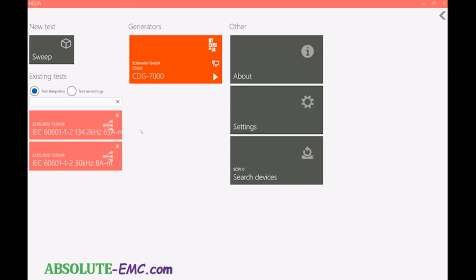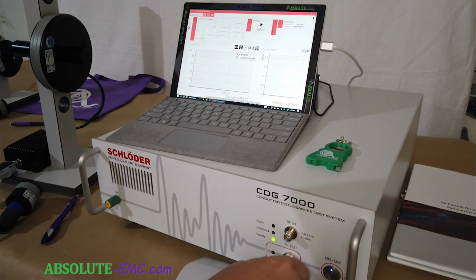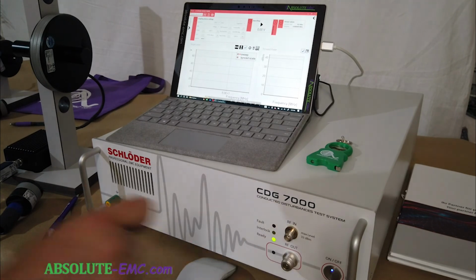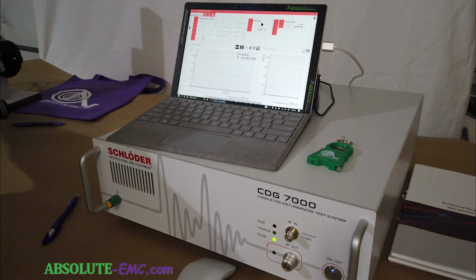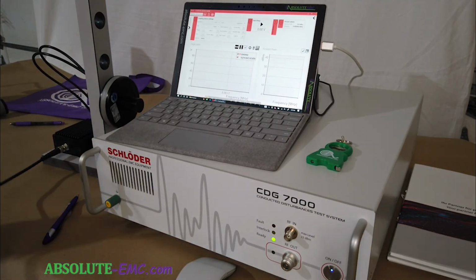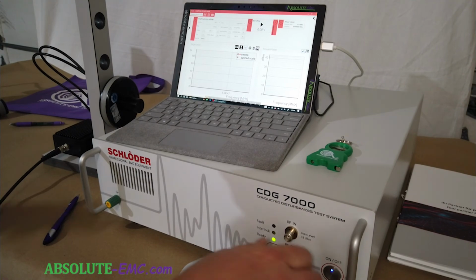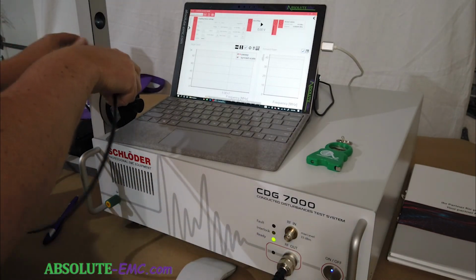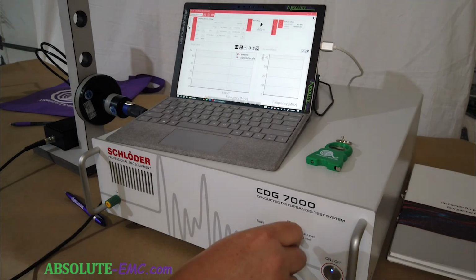So that next we have the last frequency, which is a new loop and test setup. So we'll get set for that. We'll first do the level setting. For that, we'll disconnect this setup and then bring in our other stuff. So this has a different network input, and a loop sensor, different loop sensor. Connect that in, connect that to the RF in.